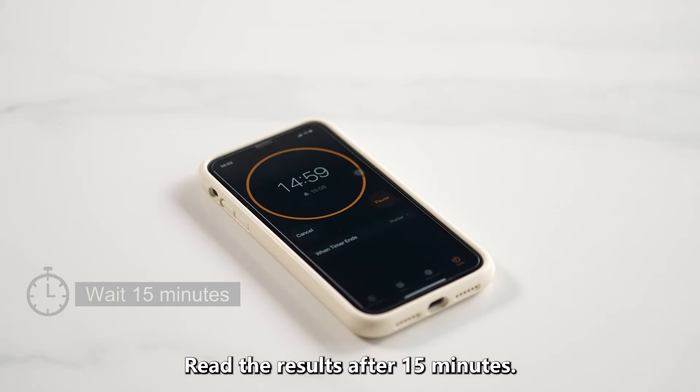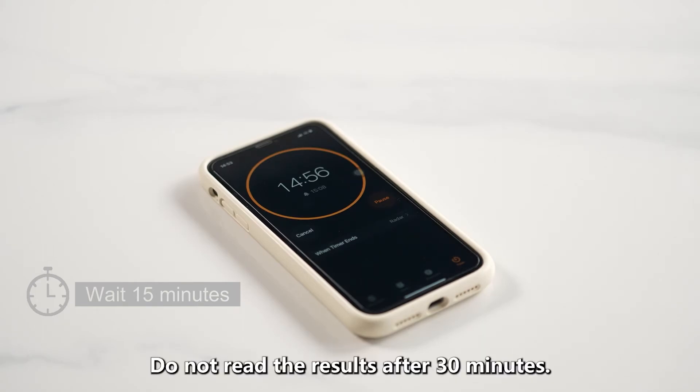Read the results after 15 minutes. Do not read the results after 30 minutes.